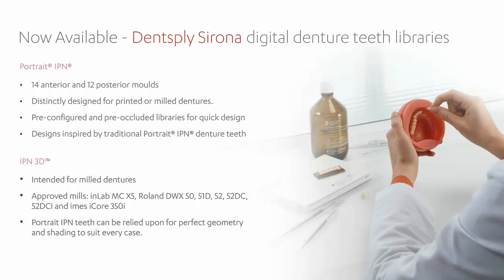Of course, it's based on the traditional Portrait IPN denture teeth, but it's also intended for milled dentures. The only drawback, of course, is that you still have to glue in the teeth, which does not make it a fully digital workflow. We wish that Dentsply Sirona had made it open for milling or for printing, but maybe they will in the future.